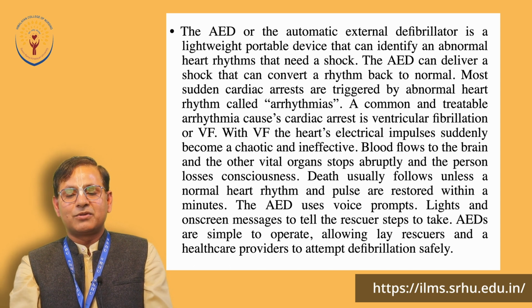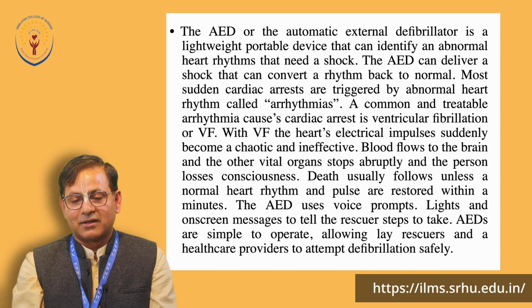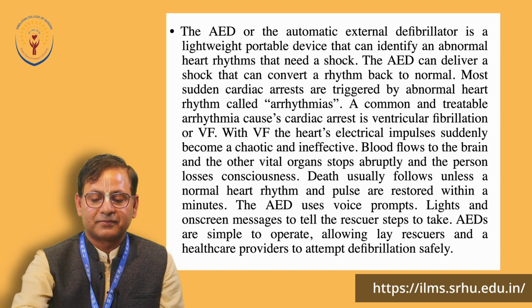The AEDs use voice prompts, lights and on-screen messages to tell the rescuers the steps to take. AEDs are simple to operate, allowing lay rescuers and healthcare providers to attempt defibrillation safely.